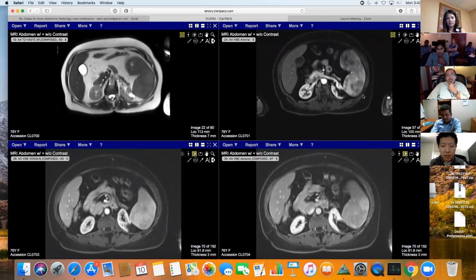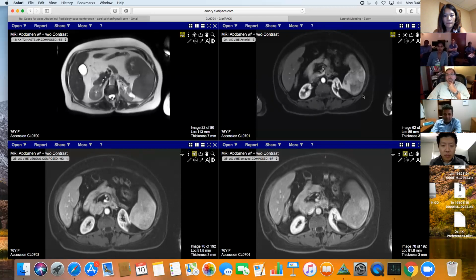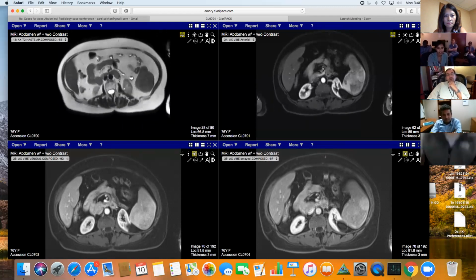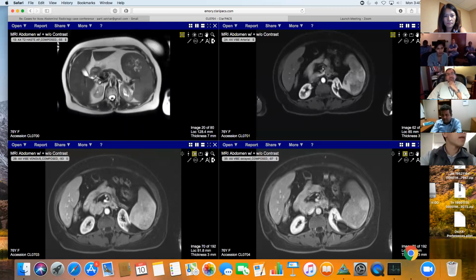I'm usually worried about such lesions. I know that a lot of splenic lesions are considered to be benign, but this looks a little too heterogeneous, particularly on that T2. I kind of wonder whether it could be angiosarcoma or something like that. Yeah, that was the other thing. I didn't know if leukemic deposits and involvement can look like that too. I certainly wasn't saying extramedullary hematopoiesis and we're done. I was saying that's in the differential along with something really bad like angiosarcoma.